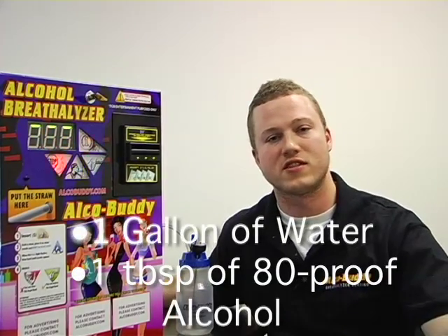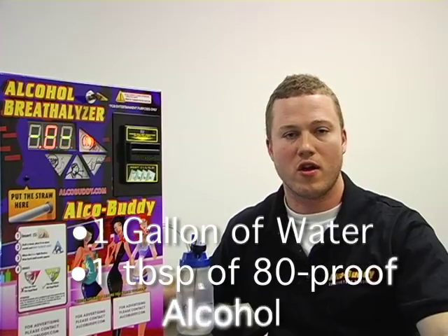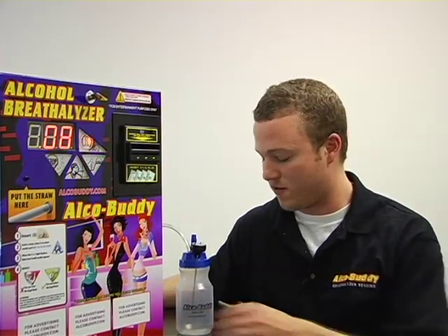The solution consists of one gallon of water and a tablespoon of 80 proof alcohol. Once you've created and thoroughly mixed the solution, the next step is to fill the AlcoBuddy calibrator, which we provide to you, halfway.